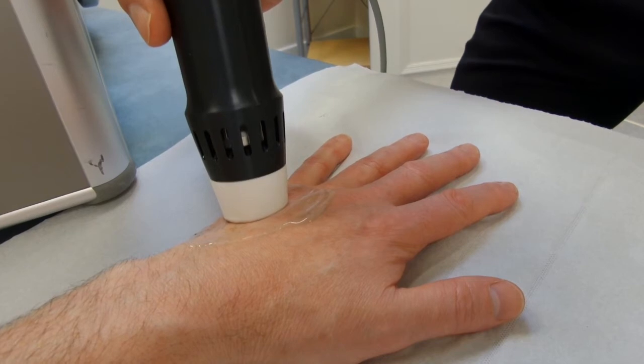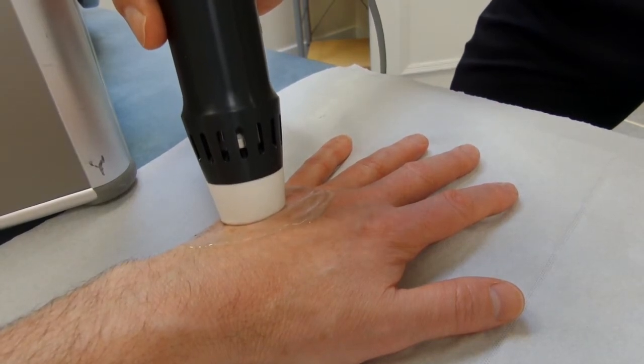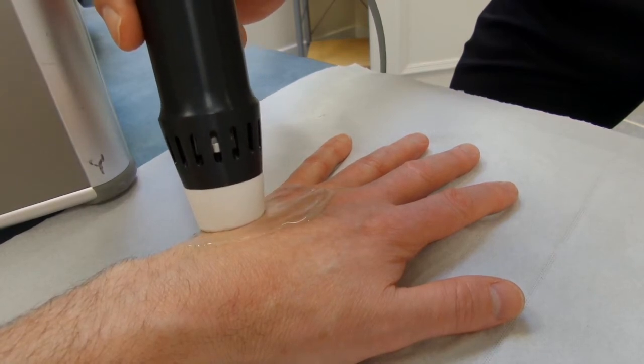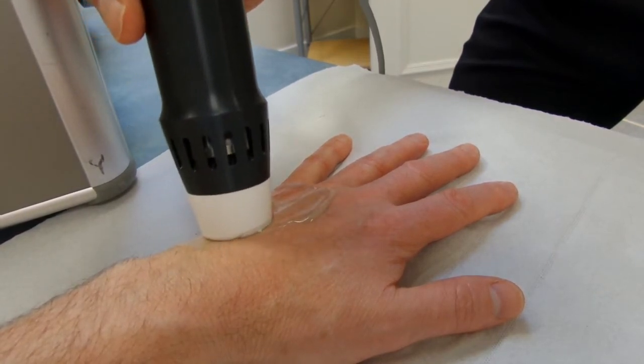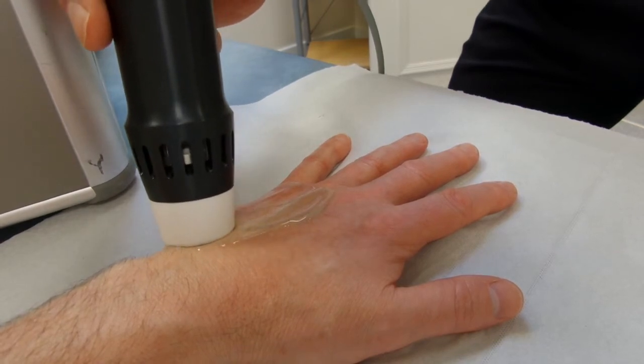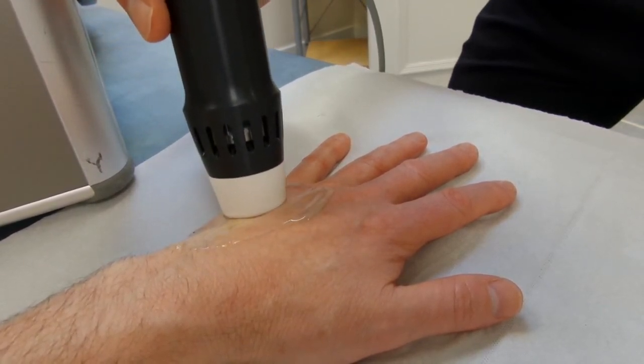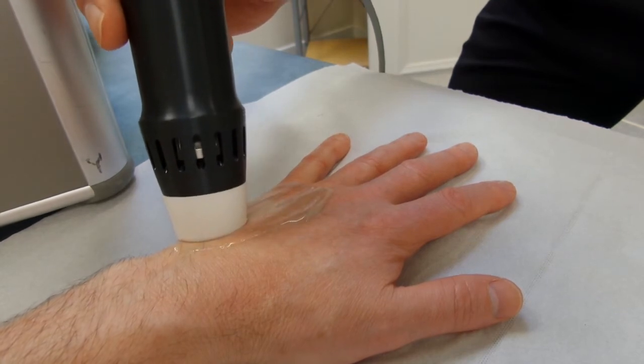Always keeping an eye on the patient's face to see how much pain they're in. If you stop in an area for too long, you'll often find that the patients will start to sweat. They often feel a bit woozy or light headed and can go quite pale. So you don't want to get those effects if you can help it.